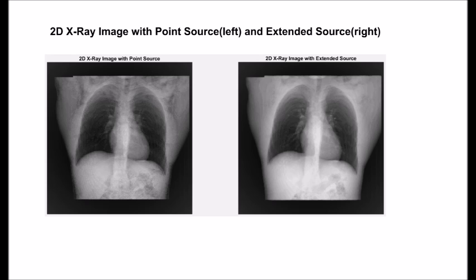Another reason for seeing the heart is that it is muscle, which is more dense than soft tissue. But ribs are very small when we compare them with the organs and muscles. Therefore, we lost visibility for ribs. The spine is occupying relatively more pixels and slices than ribs. Therefore, the spine is more visible in the image.